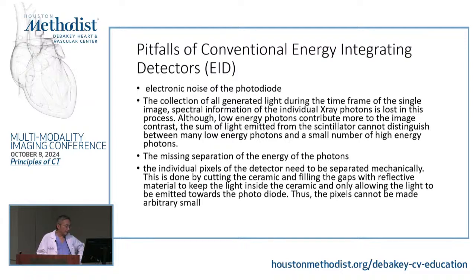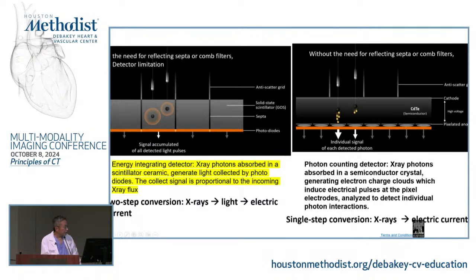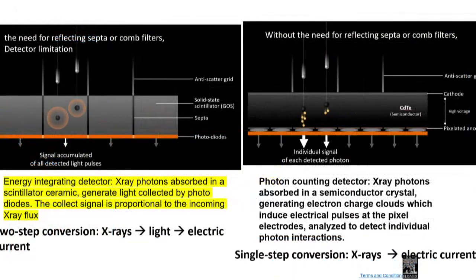So if you put it all together and you can solve those problems, this is what it will look like, the comparison between the regular CT scanner, or energy integrating detector, versus photon counting, okay? Let's follow this. If you understand this, I think you learned something today. So you see, the patient is here. This is the signal coming out of the patient, okay? So this is the detector that's facing the X-ray source, okay?